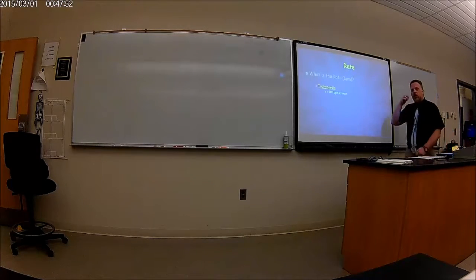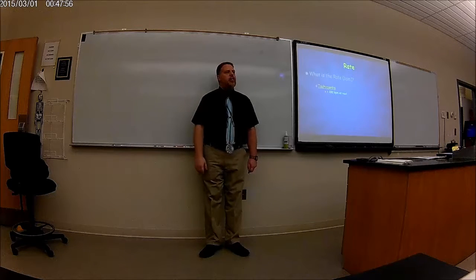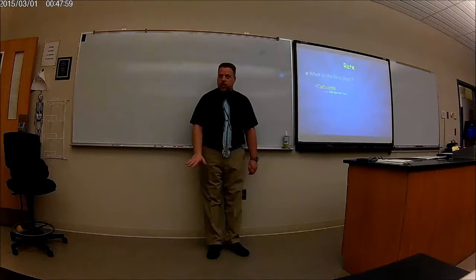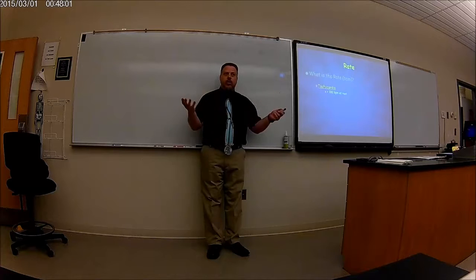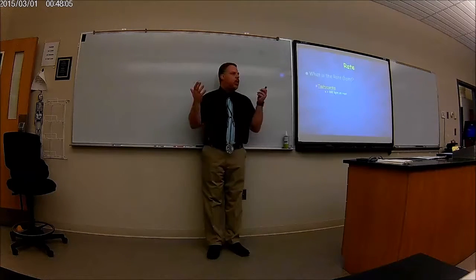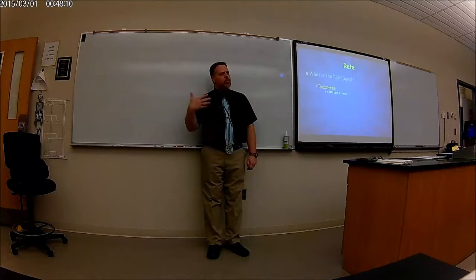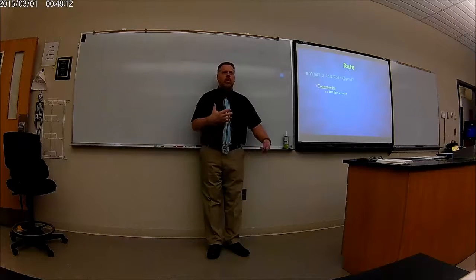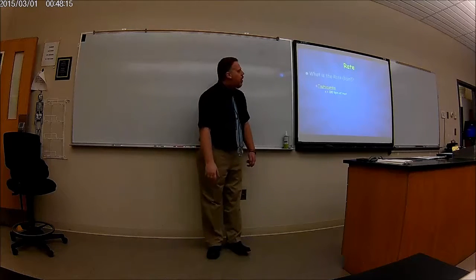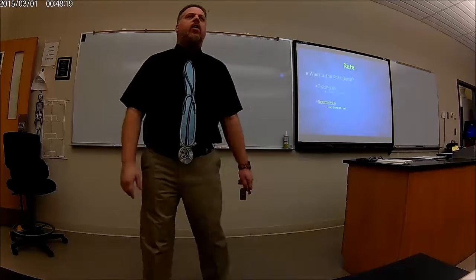So the rate, what's the rate? Beats per minute. Okay? If it's faster than 100 beats per minute, then we say it's tachycardia. At rest. Right? You're not running a marathon and then it's 150. No, that's not it. If you're at rest and you have a fever, your heart rate's going to go up. Sure, you're tachycardia then, but that's an appropriate thing because your body is trying to push the blood to where the infection is. If it's less than 60 beats per minute, we refer to it as bradycardia.